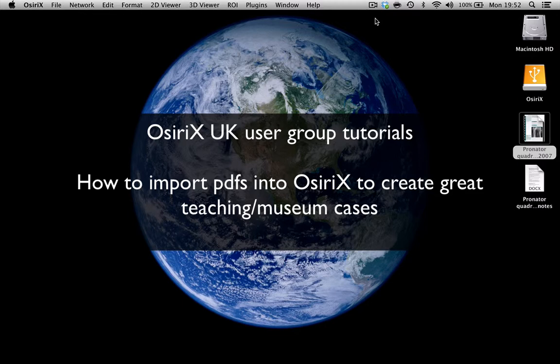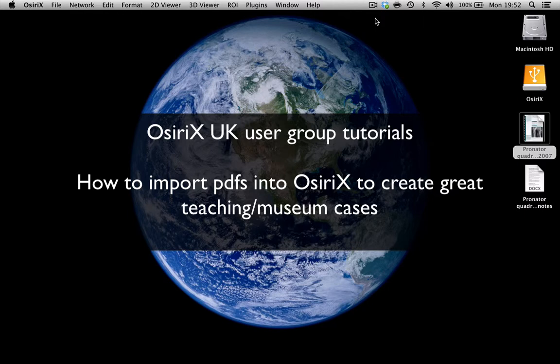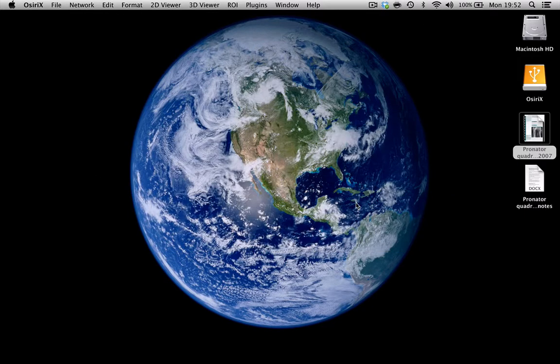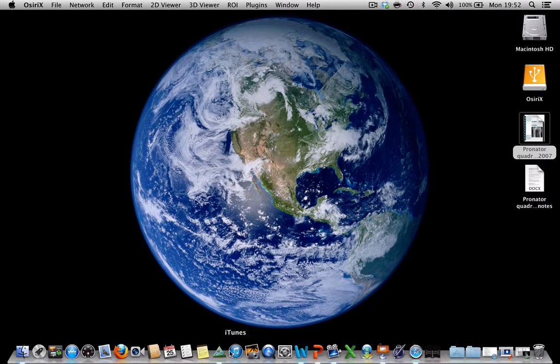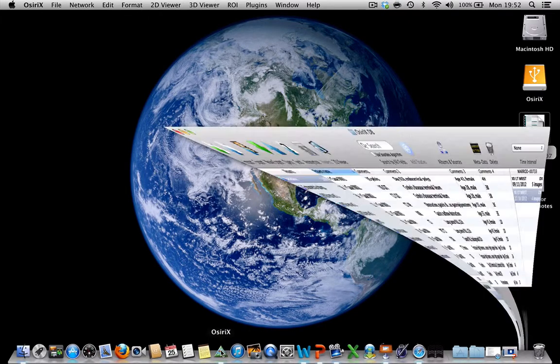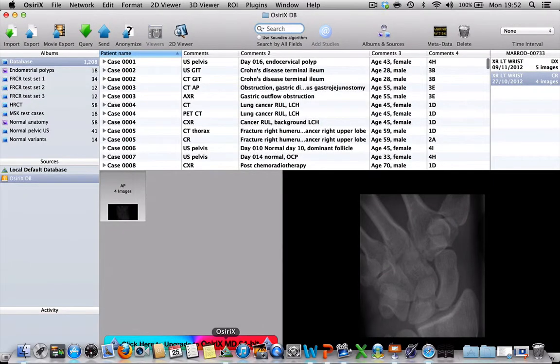Today I want to talk to you about how you can import PDF files into your OsiriX database to enhance the quality of your teaching and museum cases. So first of all, I'm going to have a little look at my main database.